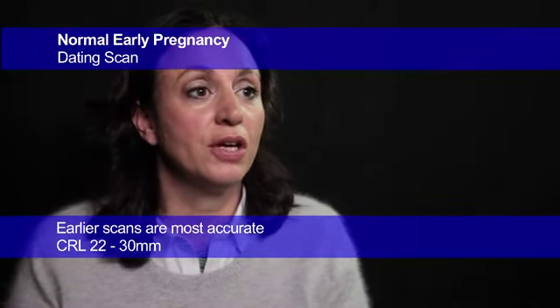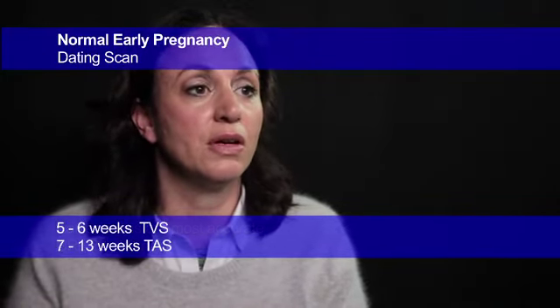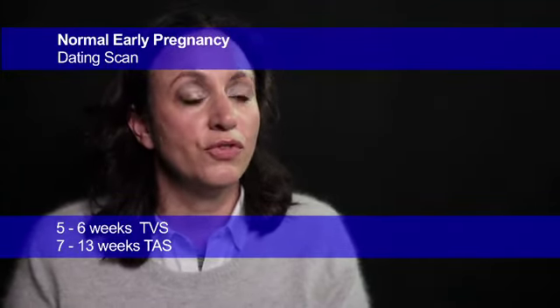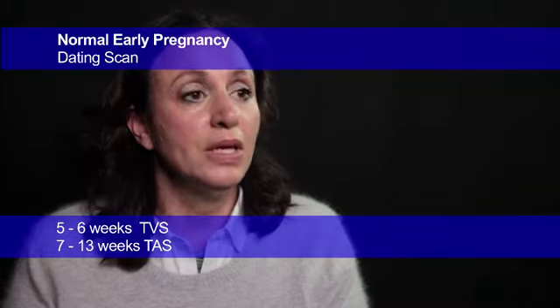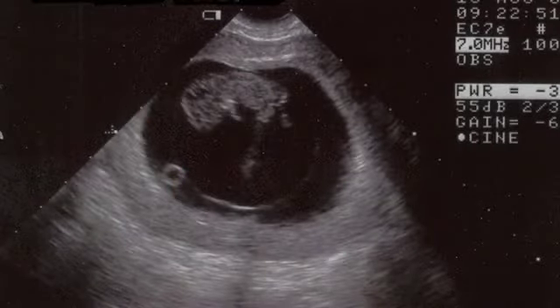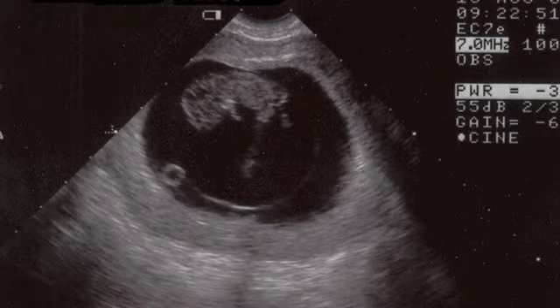When using transvaginal scanning, classically this is done at between 5 and 6 weeks of gestation. Transabdominal scanning necessitates a slightly more advanced pregnancy to get views that are good enough to achieve dating, so classically this is done between 7 and 13 weeks. The features that we look for in performing a dating scan are the gestation sac and its size, the presence of a yolk sac and its size, and the measurement of the crown rump length.